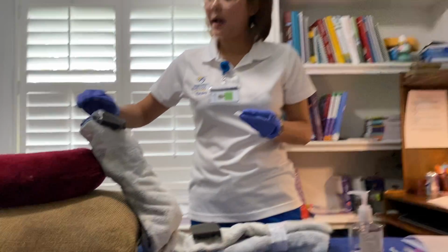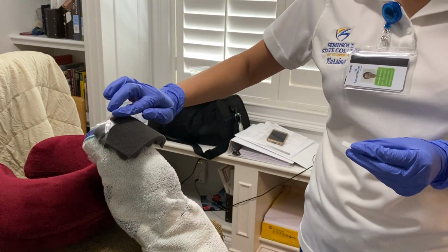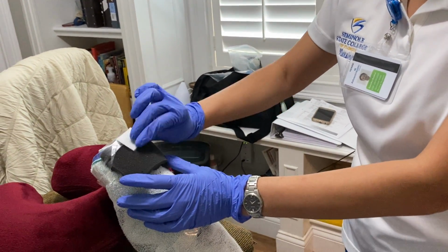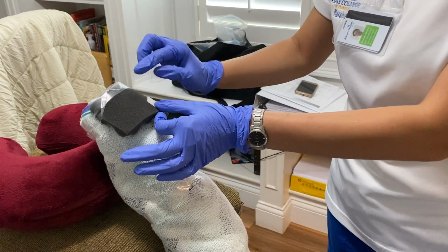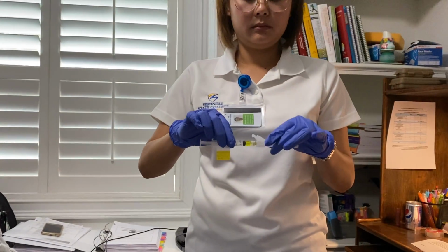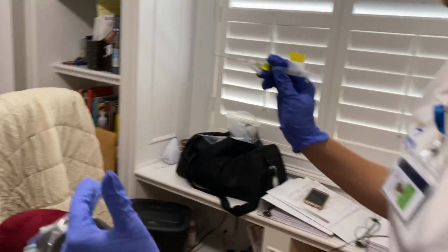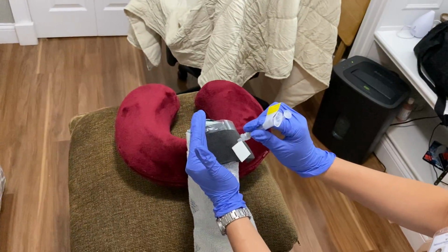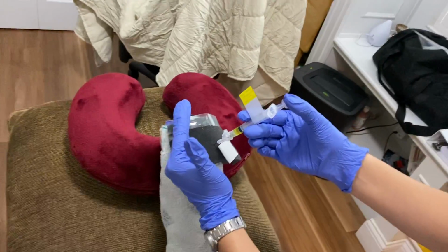Okay, so find my landmark for the deltoid. It's going to be the acromion process. All right, 2 fingers down, and right here is where my injection is going to be. Clean the injection site outward for about 15 seconds, and then let it air dry. So I put it right here so I know my injection will go right there. So I get my flu shot. All right, use your hand to pull the skin outward, and then go 90 degrees down, and then slowly inject the medication over 5 to 10 seconds using the Z-track technique.